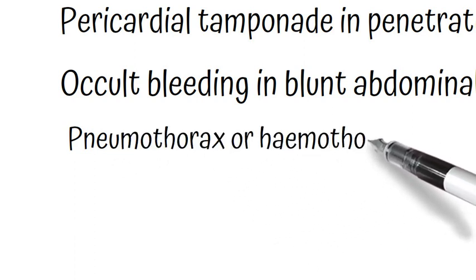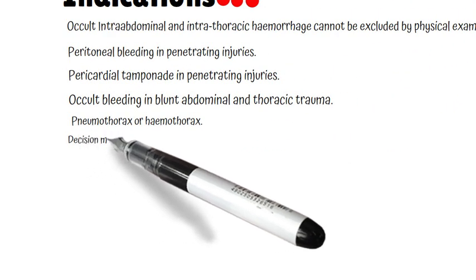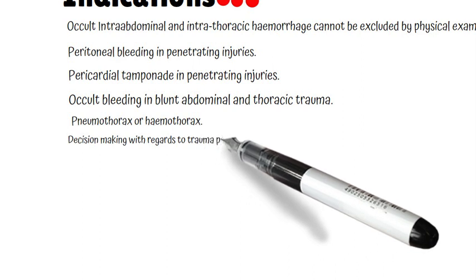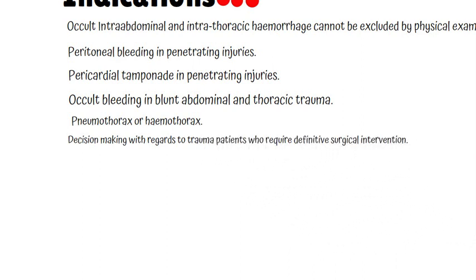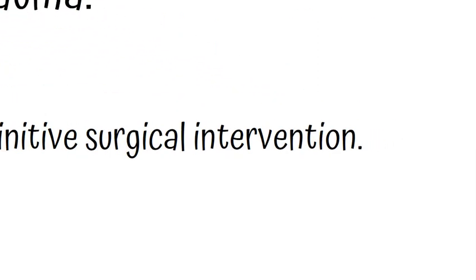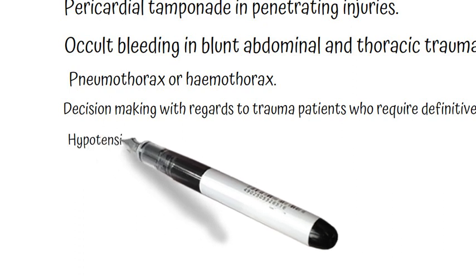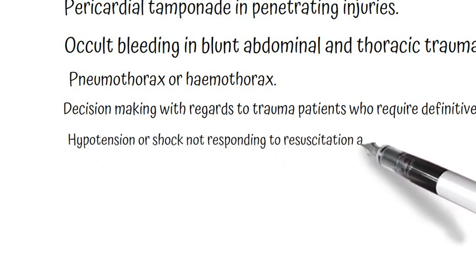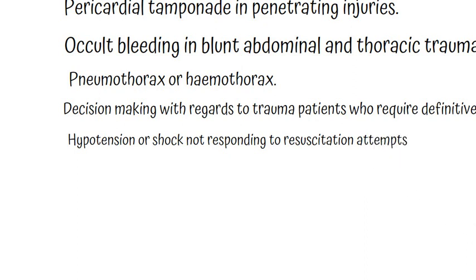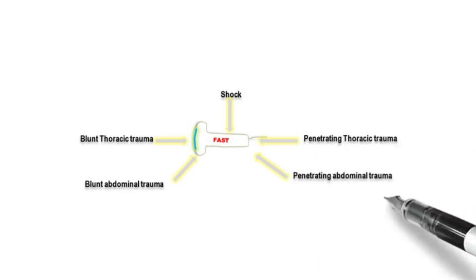FAST is sometimes performed in order to assist with the decision making when the patient would require definitive surgical management. FAST is also indicated in patients who are in shock and are not responding to resuscitation attempts. This picture shows the broad indications for FAST and eFAST.